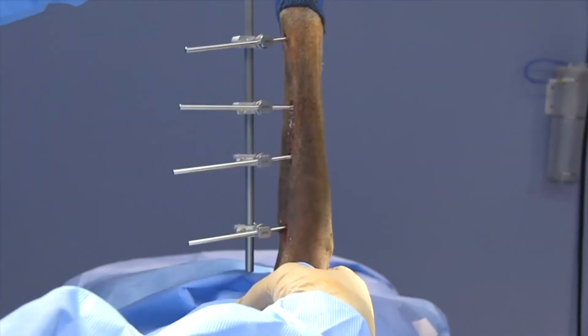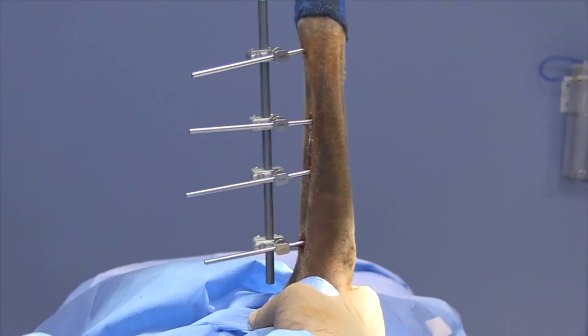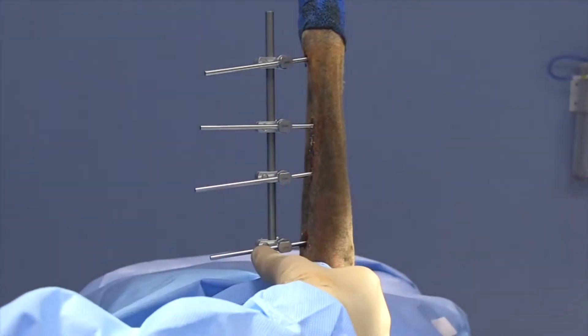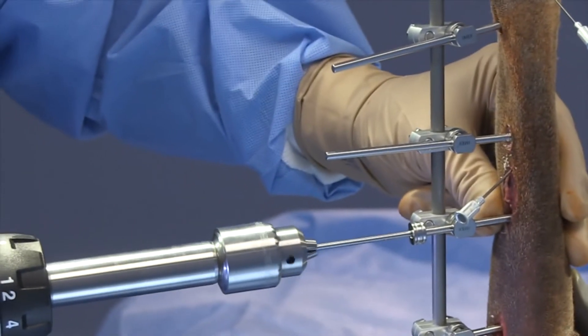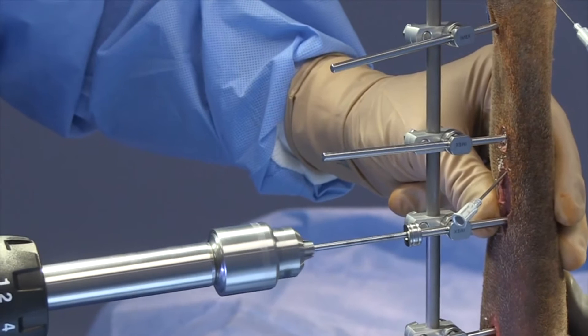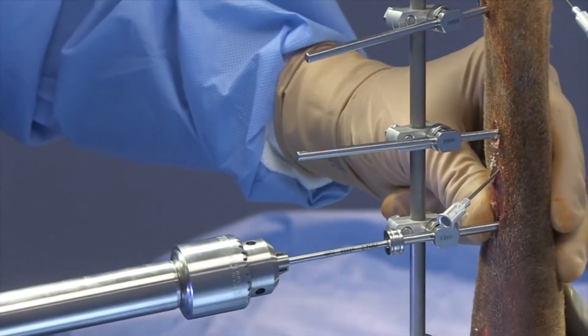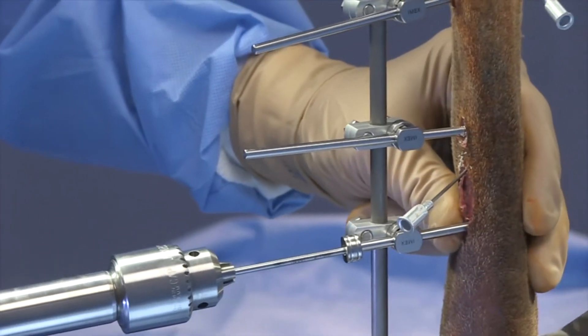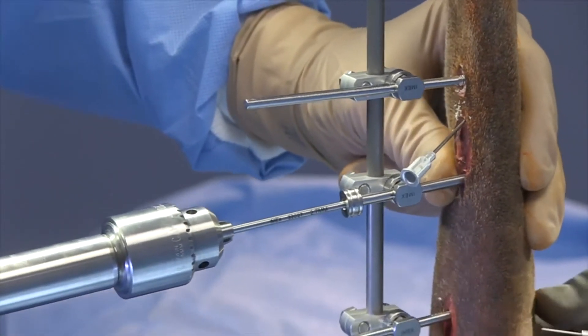Simple type 1A or 1B frames are now able to be applied with confidence. It makes life easier; you can put in simpler constructs and it affords you a lot of stability. The fixation clamp allows you to easily pre-drill pilot holes to place pins with the drill sleeve, and you can use the clamp as an aiming device. Those things all make it pretty convenient to use.